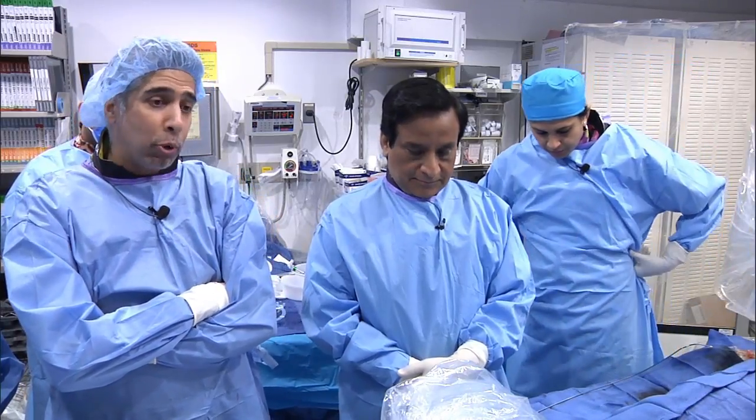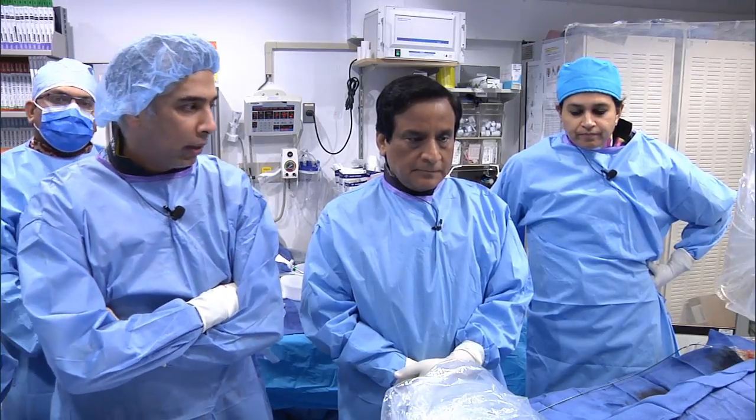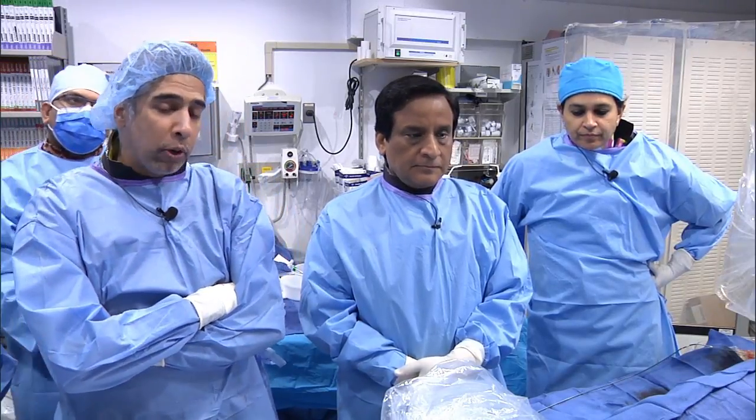So, next, a very quick follow-up is, let's remove the word radial and call it wrist access. So, how often are you doing the transulnars? We've probably done about 30 or 40 cases over the last year here, and it's generally not a primary access. As you know, the ulnar actually is a larger artery than the radial usually, the limitations being some structures that lie next to it. There are cases where there's a much weaker radial.